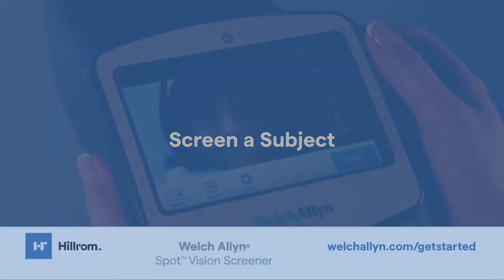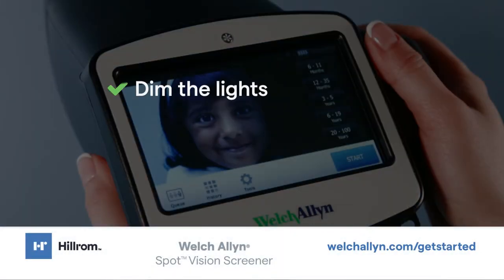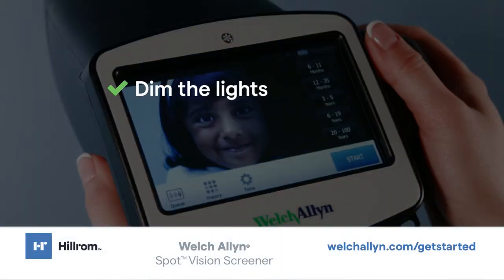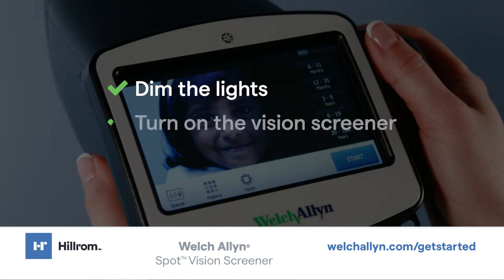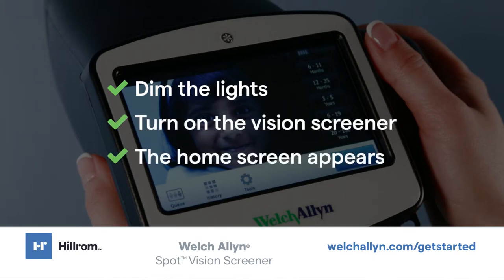Screen a subject. If possible, dim the lights. Turn on the vision screener. The home screen appears.